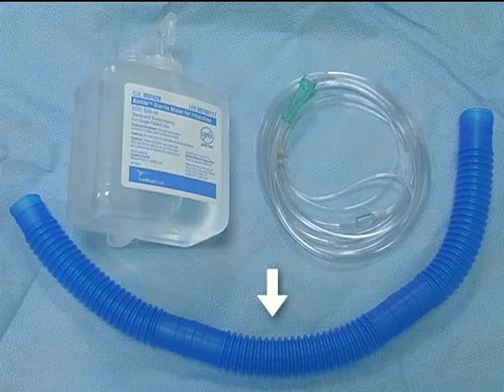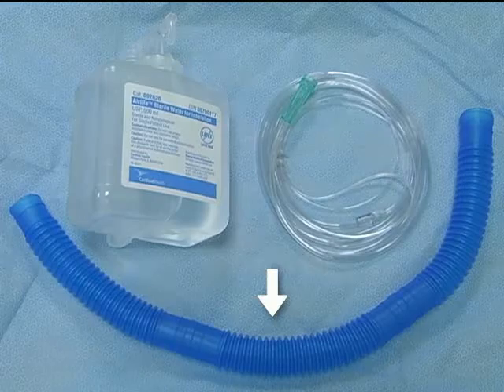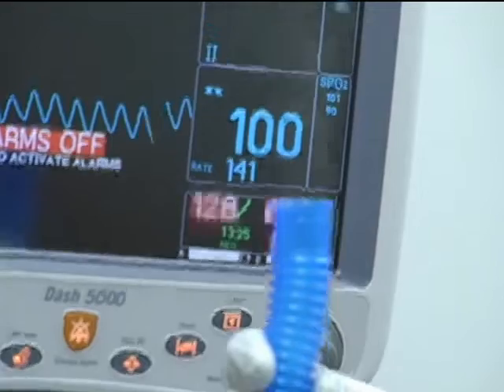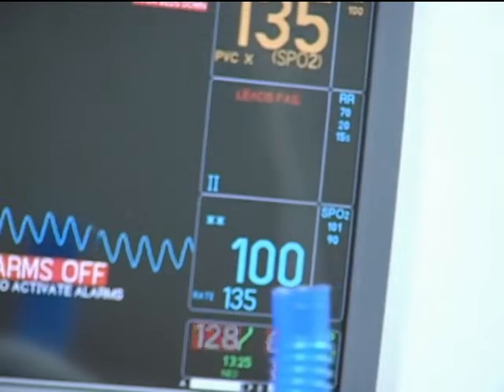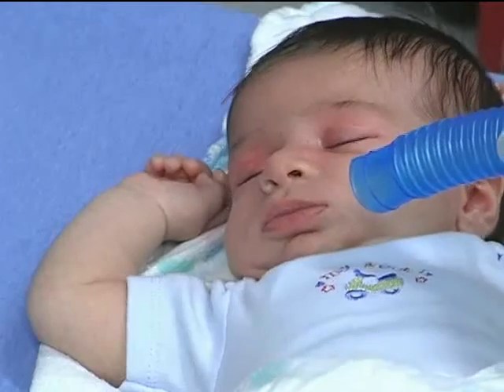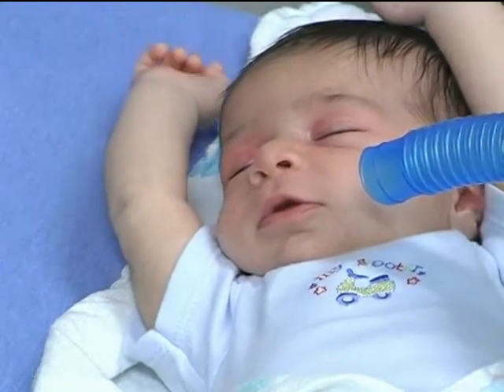Simple corrugated tubing can be used to deliver oxygen in this passive manner. A continuous oxygen source is dialed until a visible mist is emitted from the tubing. This often requires anywhere from 10 to 15 liters of flow when attached to a humidification source. Oxygen is then passively delivered over the nares and mouth of the young infant.